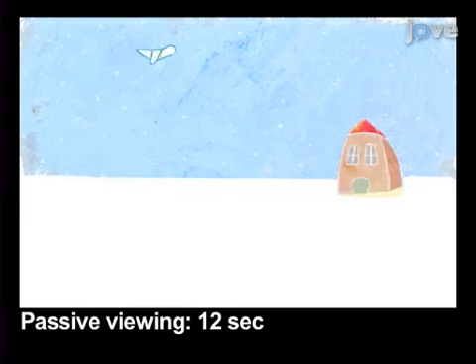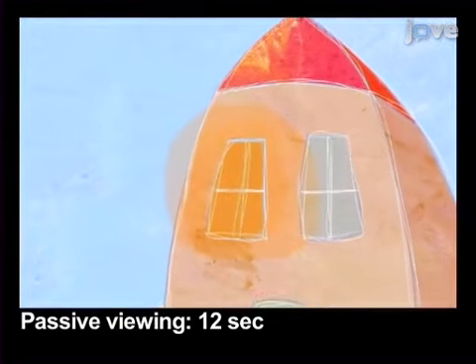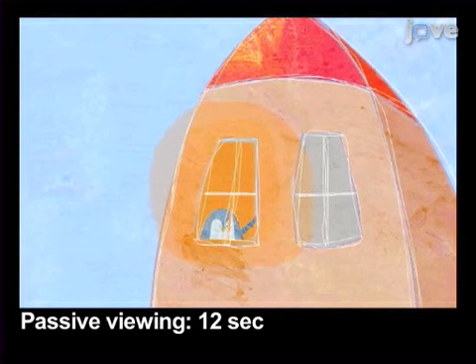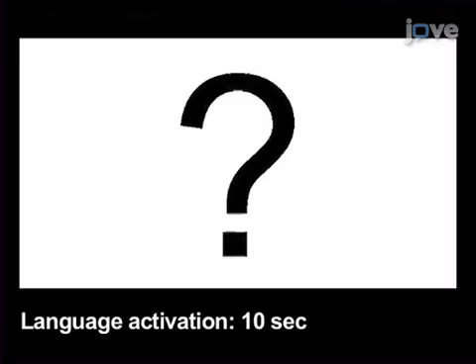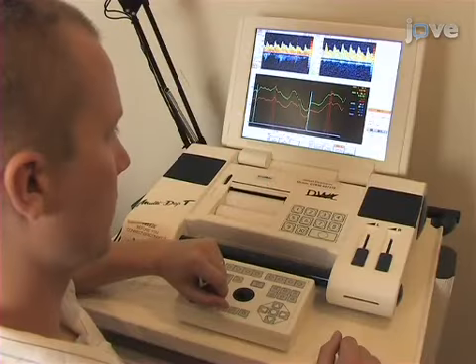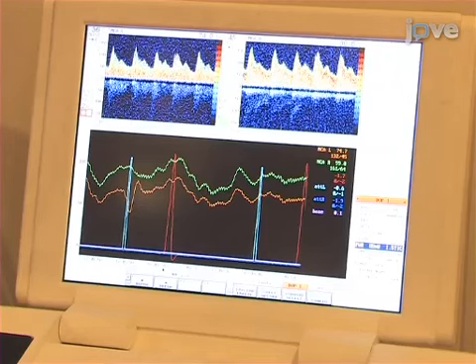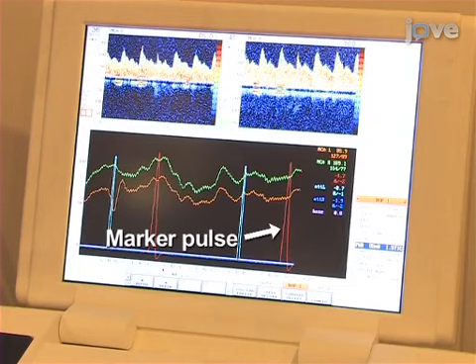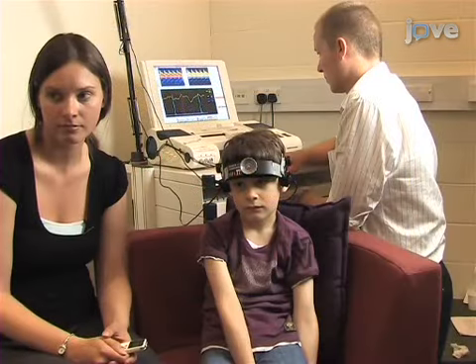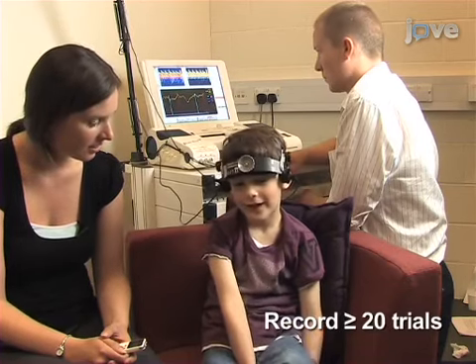Here is an example of one trial. The program on the stimulus computer maintains accurate timing of events and sends a marker pulse to the Doppler data file to indicate onset of the language activation period. For this procedure with children, we record 30 trials. We recommend a minimum of 20 trials for accurate lateralization estimation.